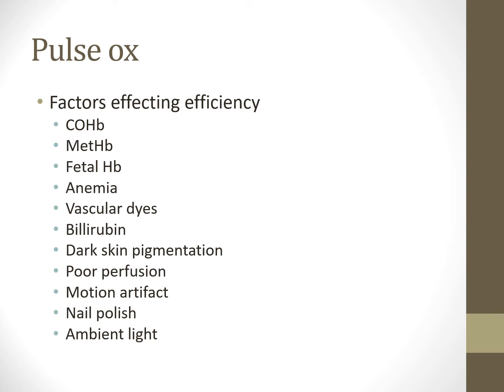Anemias, any type of vascular dye, so that they've had some sort of vascular dye for a procedure. If their bilirubin levels are up, of course, with your liver failure patients or in the NICU where their bilirubin levels are up, if they have darker skin pigmentation, if their perfusion's poor, which is very, very common, motion artifact, look at the PEDS unit, that's a very classic case there, nail polish, which nowadays, who knows, nail polish, and then ambient light, of course, can easily all play a factor into this.